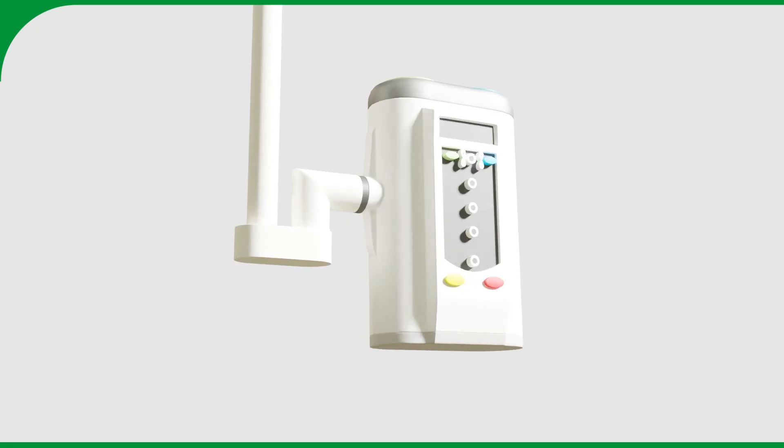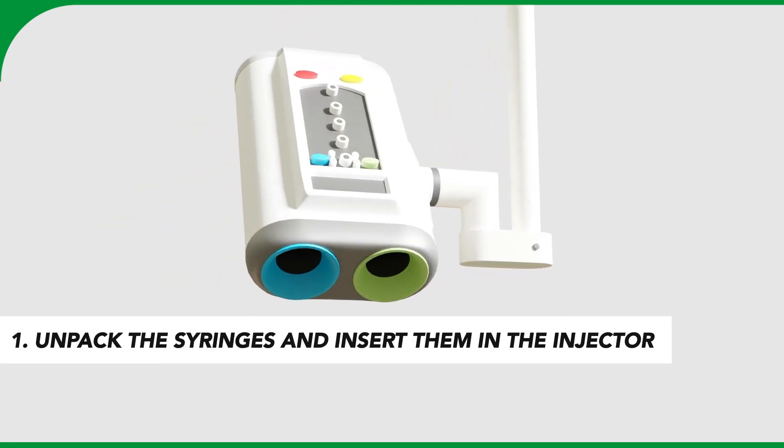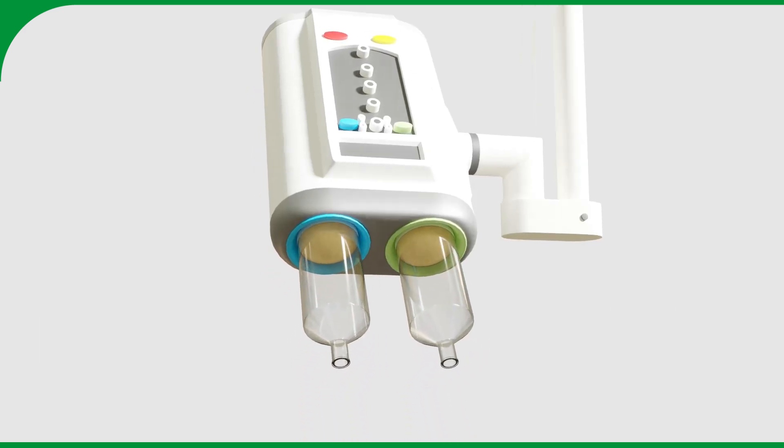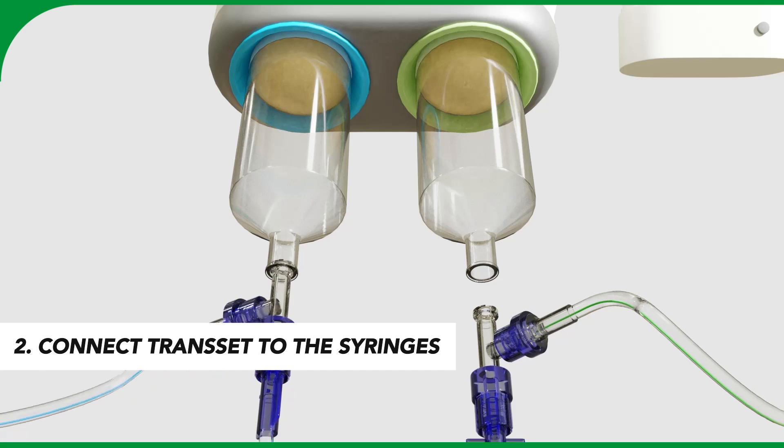Once a day, unwrap the syringes and insert them in the power injector. After unpacking, the trans set needs to be attached to the syringes.